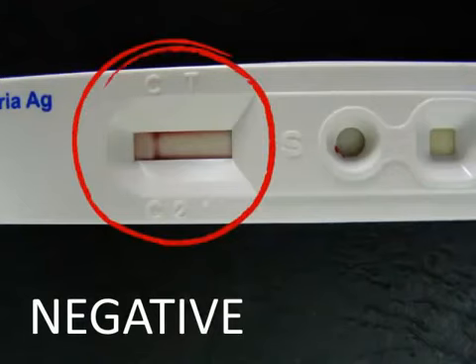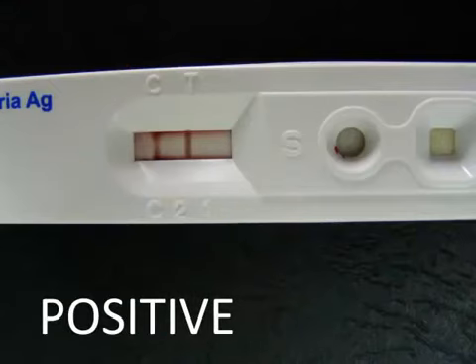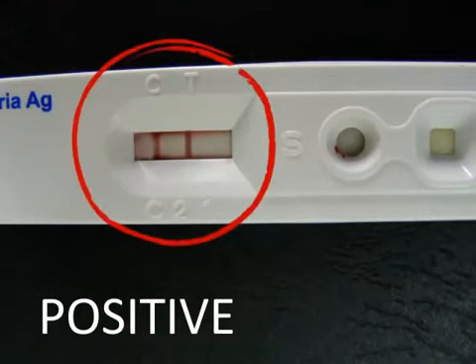Interpretation of results. For a negative result, one colored line appears in the control region C, and no apparent colored line appears in the test region T. For a positive result, 2 distinct colored lines appear. One line should be in the control region, that is C, and another line should be in the test region, T.